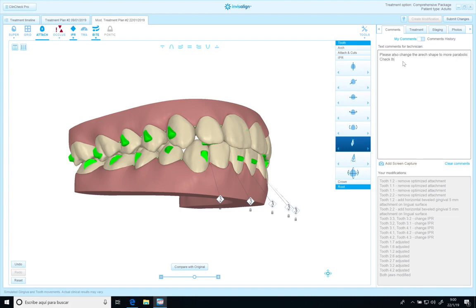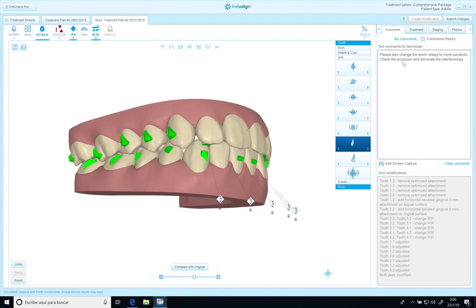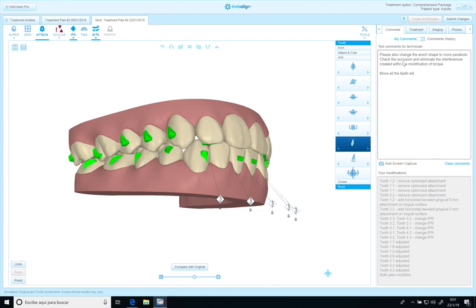Check the solution and eliminate the interference created with the modification of torque. Move all the teeth with all the aligners.